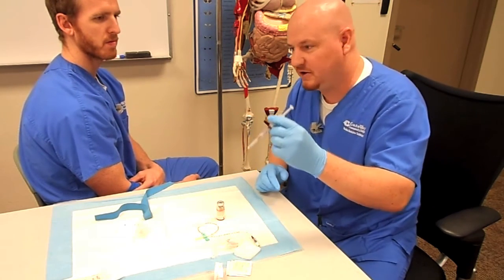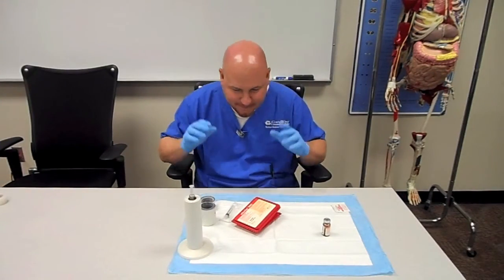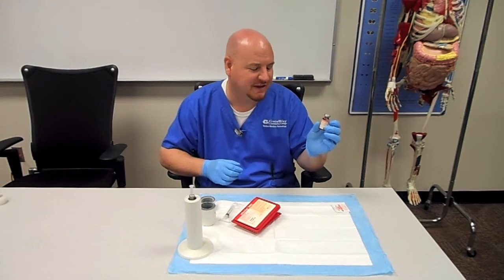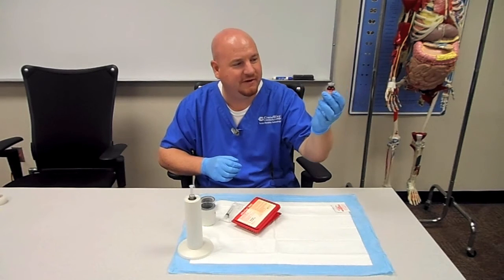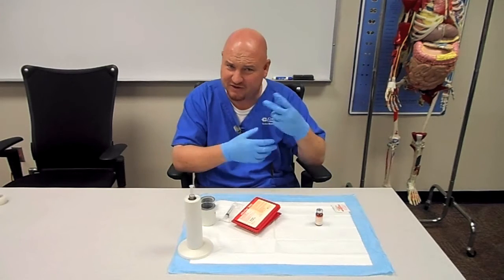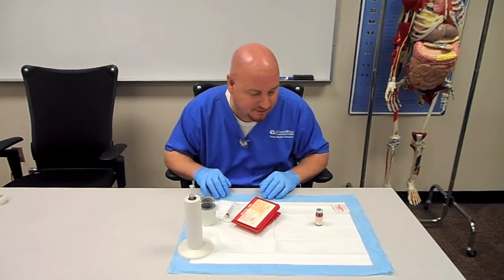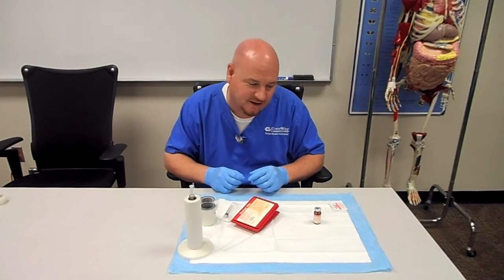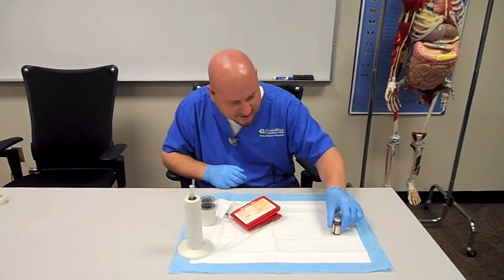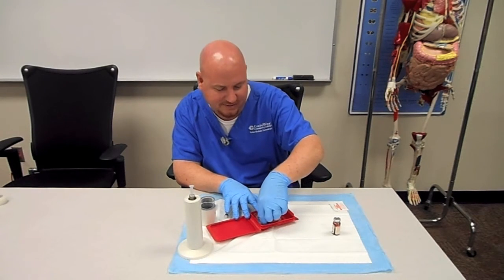Now the needle is capped and can go directly into a cold sharps container. Back in the hot lab, I want to gently invert the reaction vial a couple of times to make sure that all the contents have a chance to mix and that the stannous ions are going to be able to diffuse evenly into all of the red blood cells. You don't want to do that too vigorously or you might damage the red blood cells — just gently invert a couple of times. We're almost up to our five minutes, and I'm going to start preparing the supplies out of the UltraTag kit, which comes in all these little pieces.